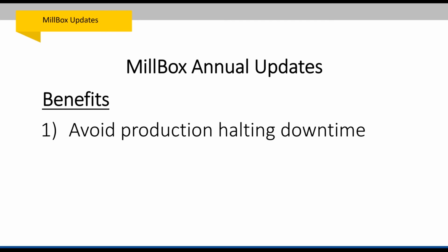Usually what feels like a bug or some kind of computer issue is actually just a disconnect between Windows. A lot of times Windows has done an update and you just haven't done an update on your CAM software. The same thing can happen on the CAD side.